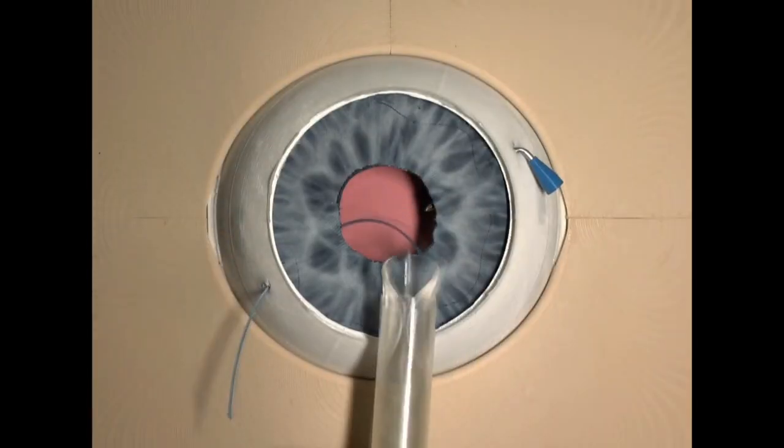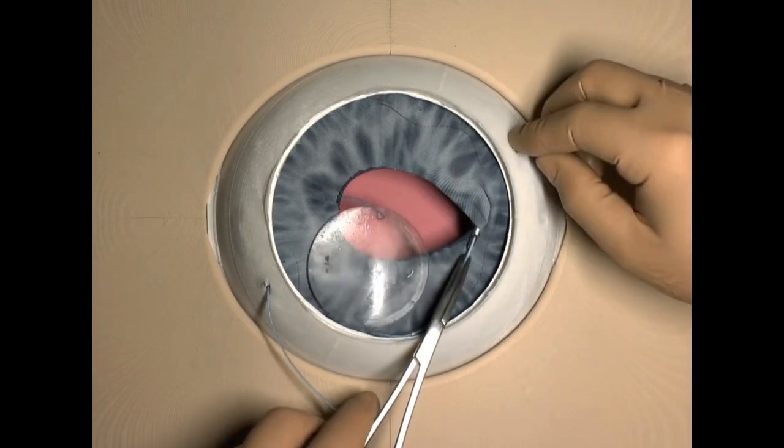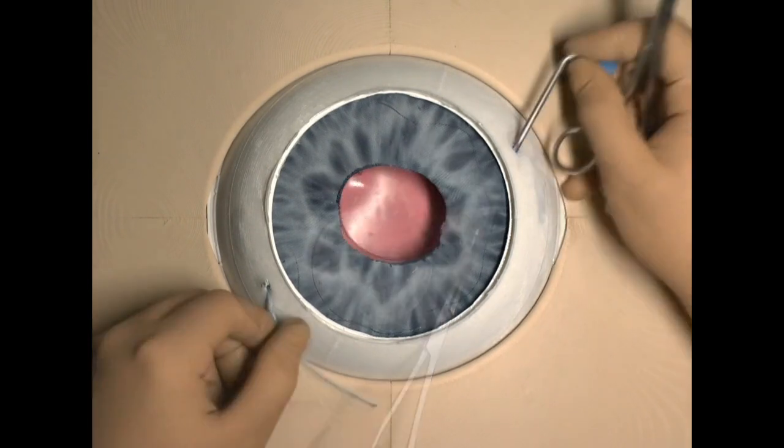It would be helpful, for example, if the trailing haptic were significantly longer and could be externalized through sclero-tunnel before implanting the lens optic.